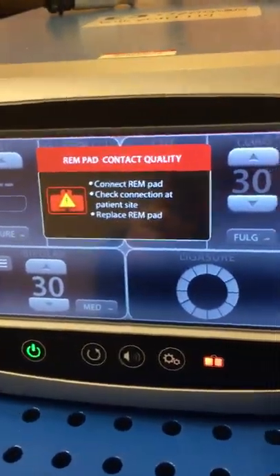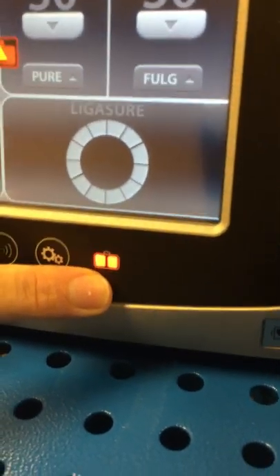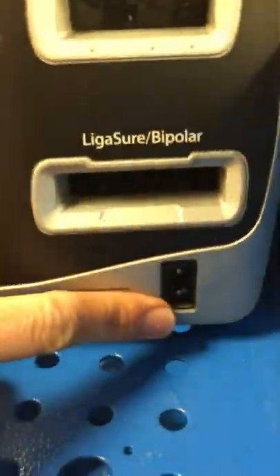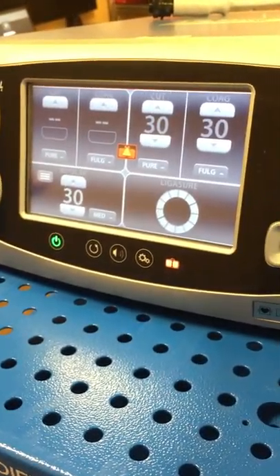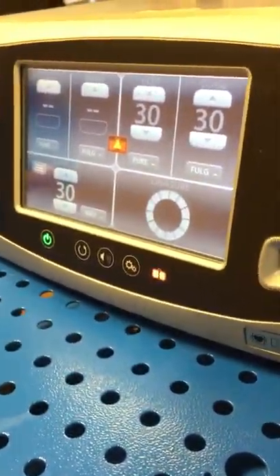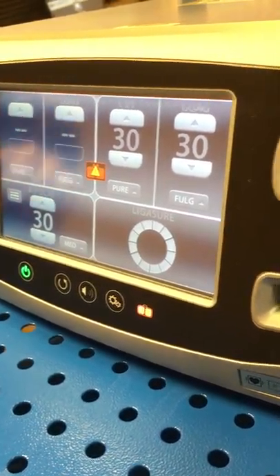You'll notice on this front screen you've got an error right now — it's the REM pad contact quality error. It's just alerting you that there's no pad currently plugged into the machine. This red light also indicates that there's no pad plugged in. Once you plug a pad in, this would illuminate green as long as it's got good contact quality on the patient. The pad goes in right here — this is the port for your REM pad. Once you've got good contact on your patient and a pad plugged in, this will turn green and this error on the screen will go away. This is a safety feature to make sure that when using monopolar energy, you always have a grounding pad — it will not allow you to deliver energy to the patient without that closed circuit. There has to be a pad used.